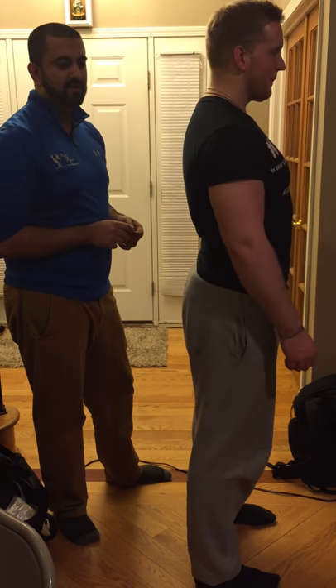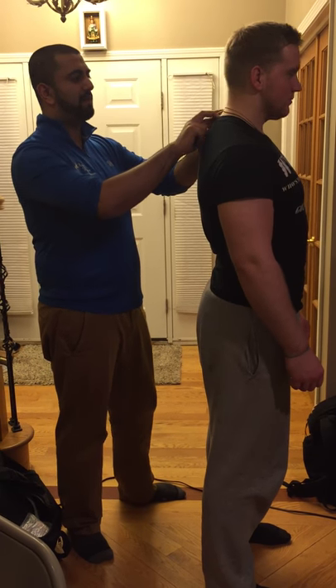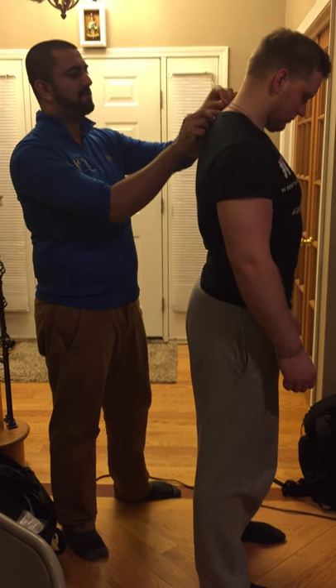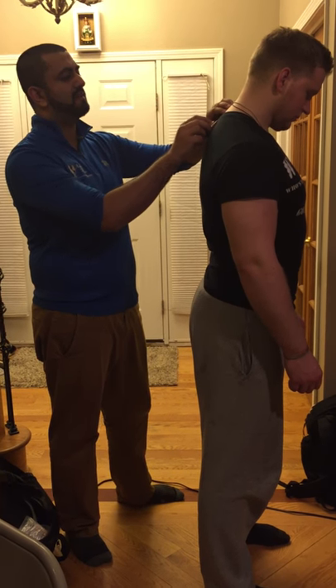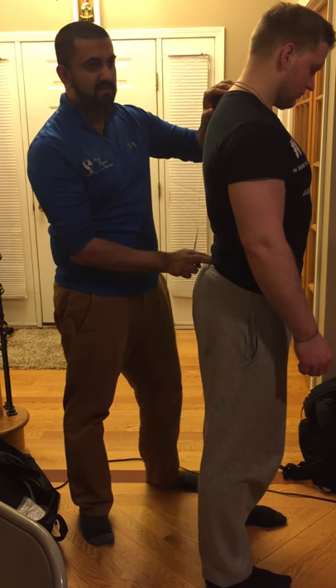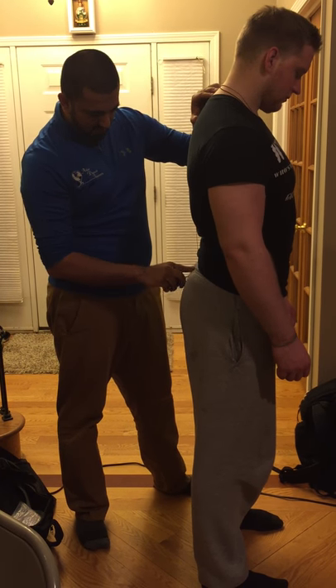Now we're going to do forward flexion of the thoracic and lumbar spine. I'm going to palpate his C7, put my tape measure right at C7, and then palpate his PSIS and measure in the middle.